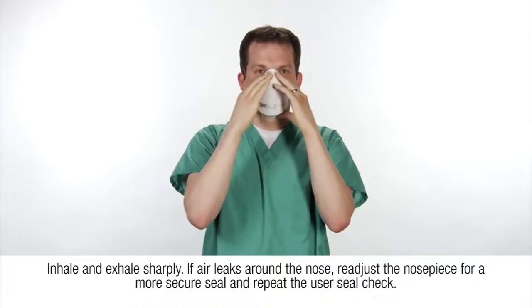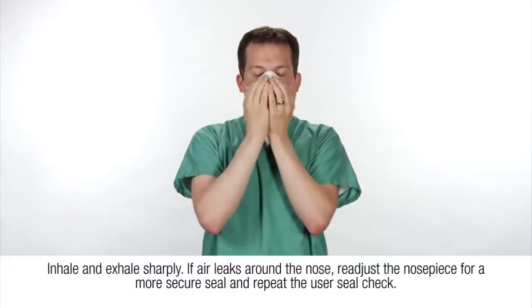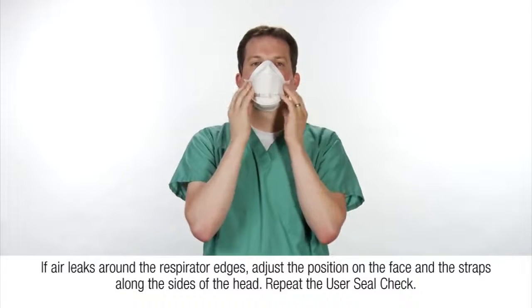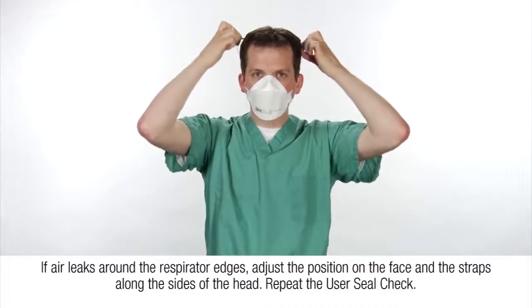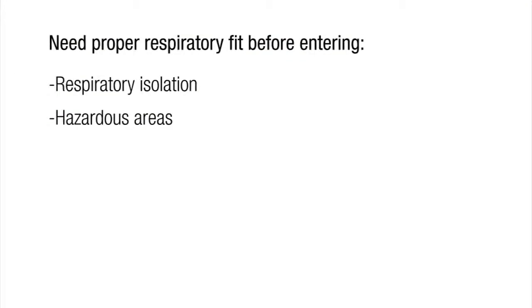If air leaks around the nose, readjust the nose piece for a more secure seal and repeat the user seal check. If air leaks around the respirator edges, adjust the position on the face and the straps along the sides of the head and repeat the user seal check. Do not enter a respiratory isolation or other hazardous area where respirators are required until you are assured of a proper fit.